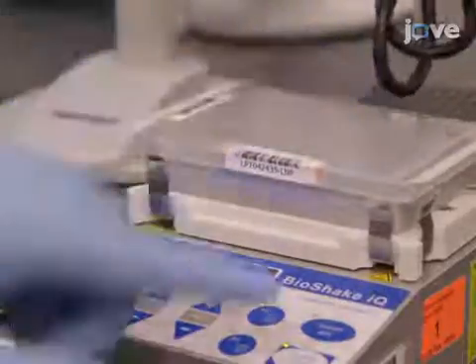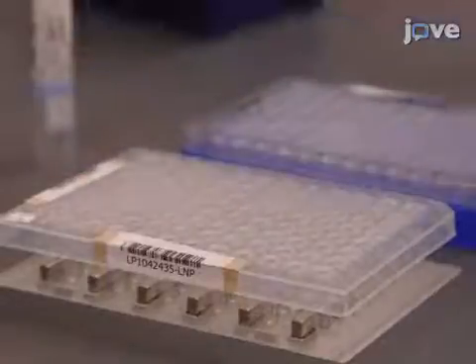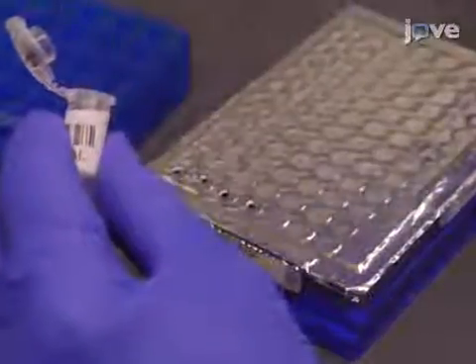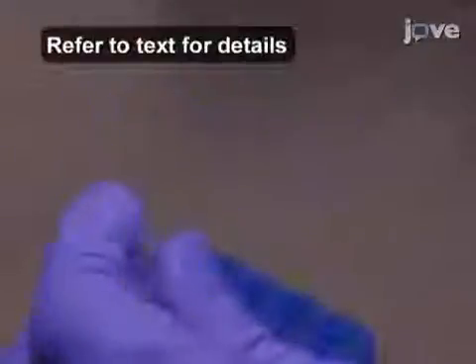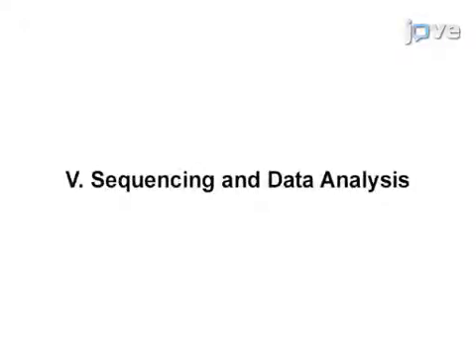Then shake the LNP at 1800 RPM for 5 minutes. Place the LNP back on the magnetic stand and after the supernatant has cleared, transfer 30 microliters of the solution to previously prepared library normalization storage buffer 1 in the storage plate. Then add 5 microliters of each sample to be sequenced to a labeled pooled amplicon library, or PAL, 1.5 milliliter tube. Clean and load the flow cell.